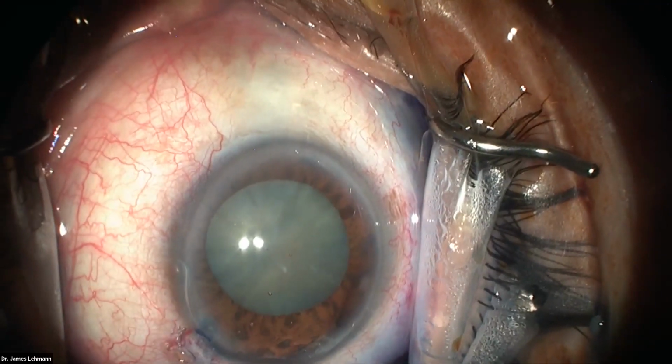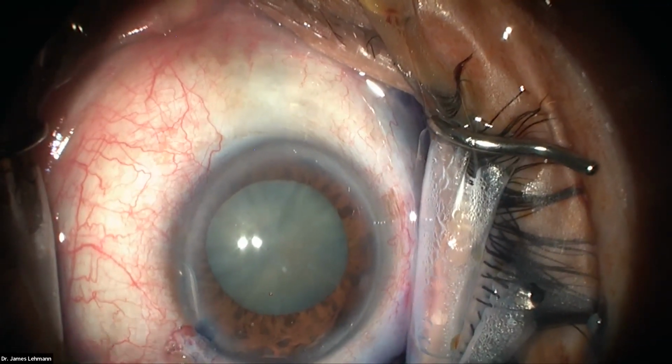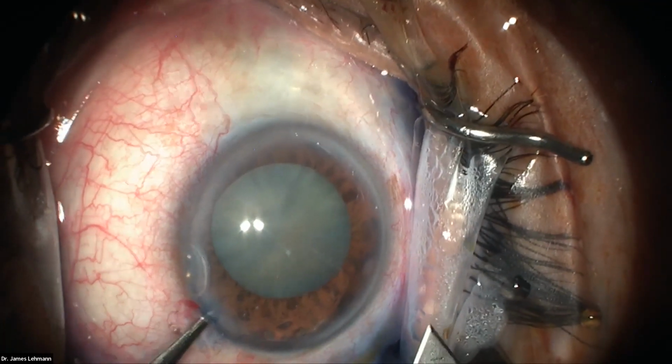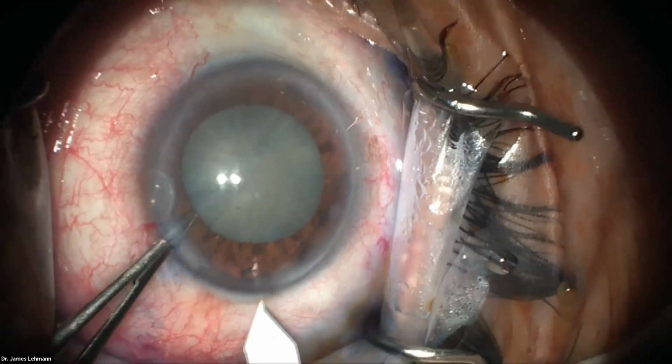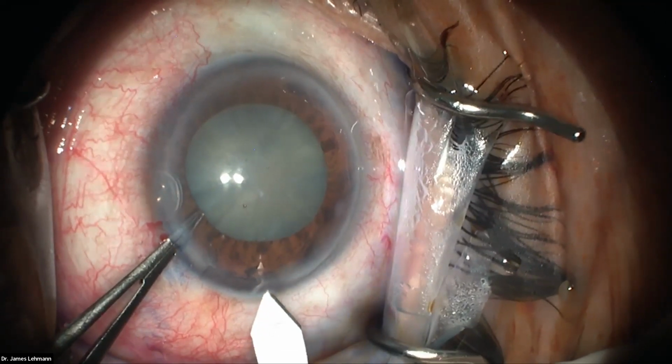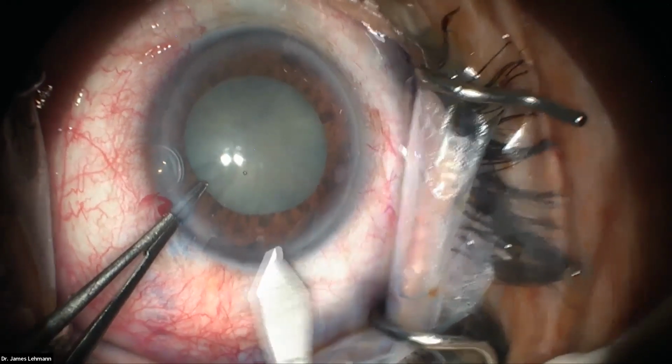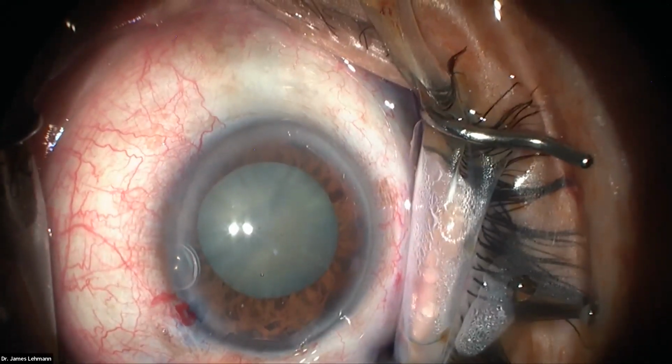Okay, now we have a nice deep chamber. Now we're going to make the main wound. So I'm sitting temporally, like I said, and then I close the tips of the 0.12, insert in my paracentesis, and I'm going to go right at the limbus. I'm going to put a little entrance there and then a nice single move. And I have a nice rectangular, almost square incision.